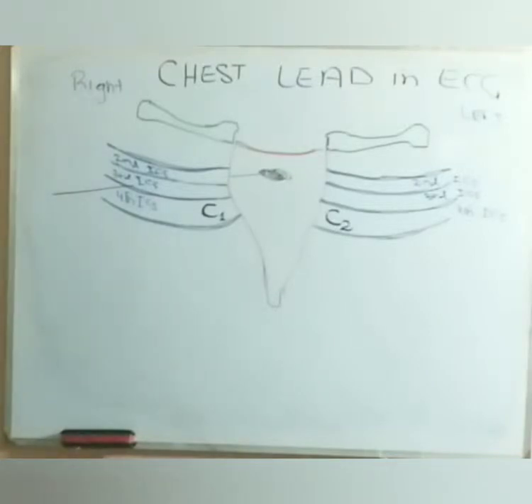Now we do not place chest lead 3 first. First we have to place chest lead 4, and then we will decide about chest lead 3.